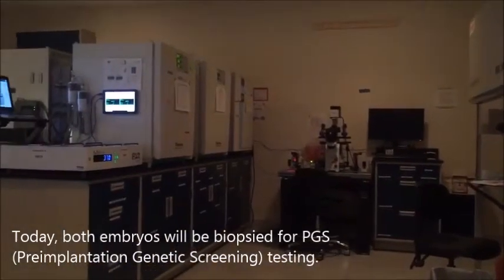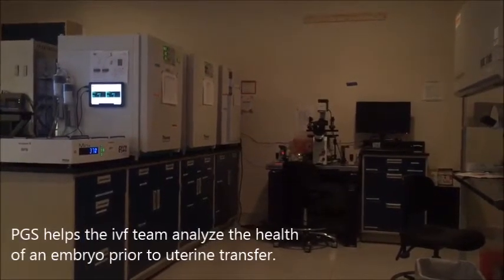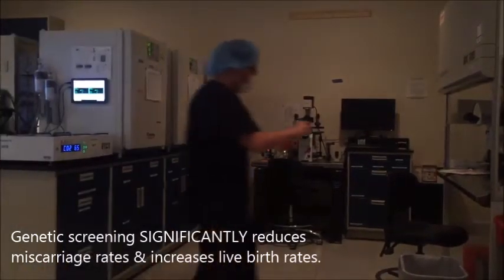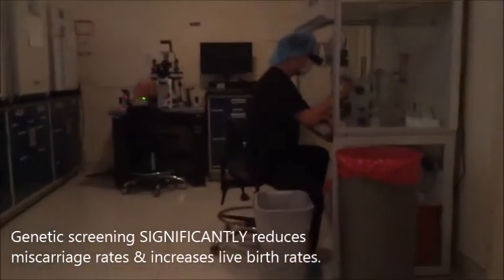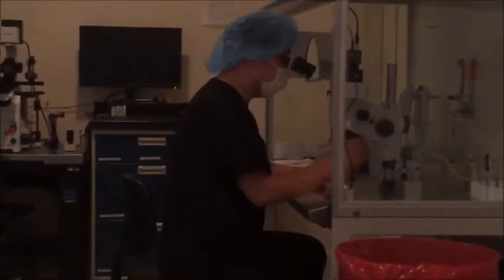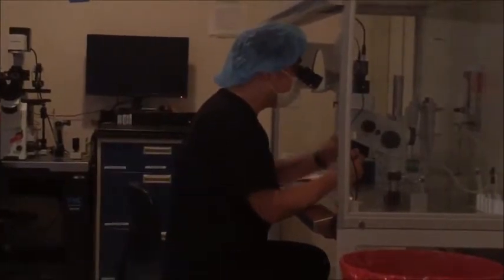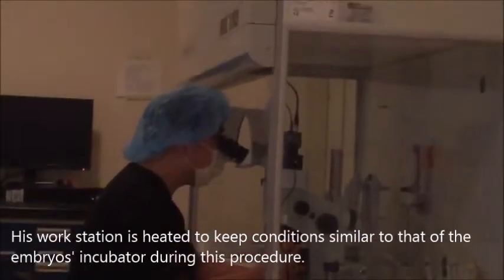What happens for embryo biopsy is they have already made a small hole in the zona that surrounds the embryo. Today they're going to look under the microscope and actually pull out three or four cells, which are called blastomeres, and put those in a separate vial. Those are part of the trophectoderm, as Dr. Kim was saying.